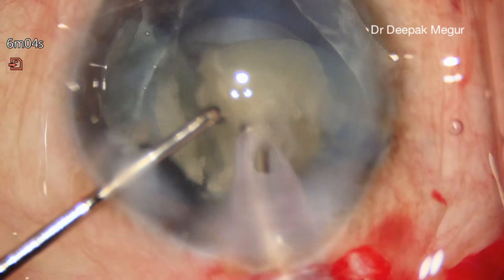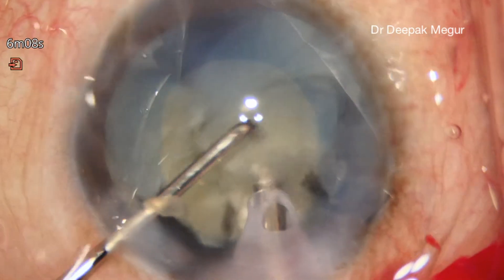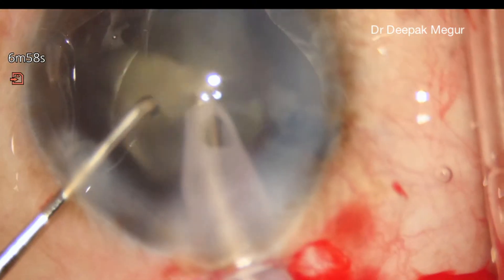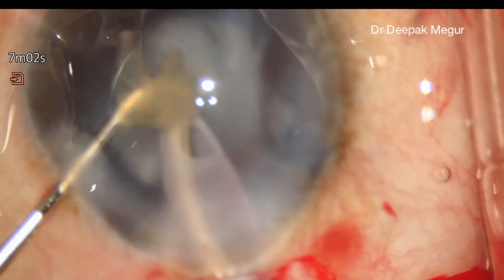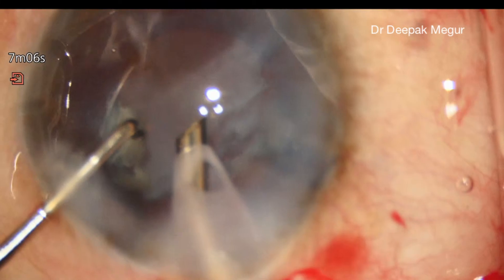It's critical to note that these cataracts don't have any epinuclear shell. So when you're trying to remove the last piece, we need to be aware of this and stepping down on the parameters will help us.